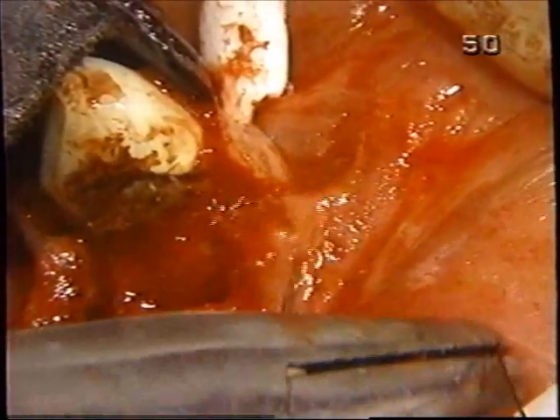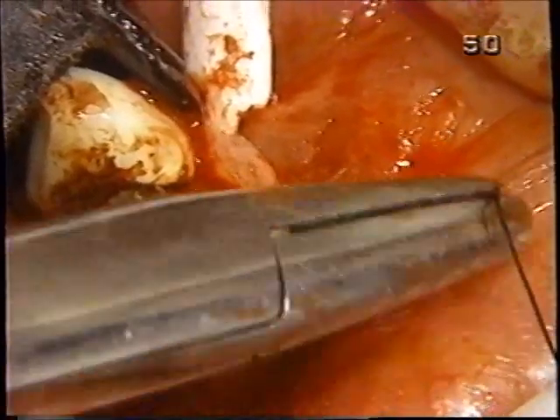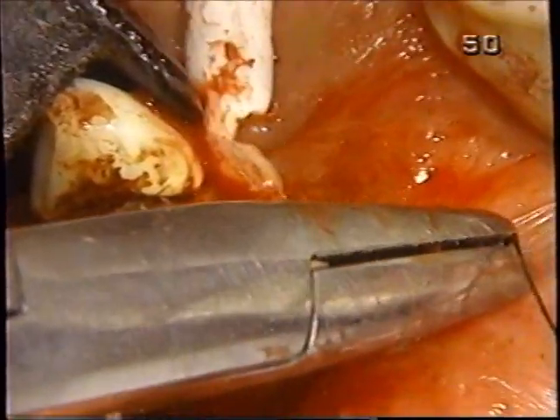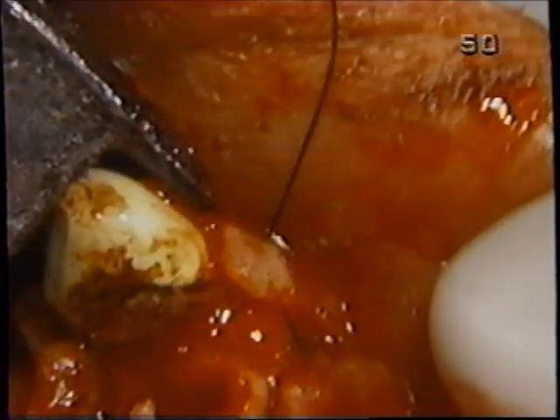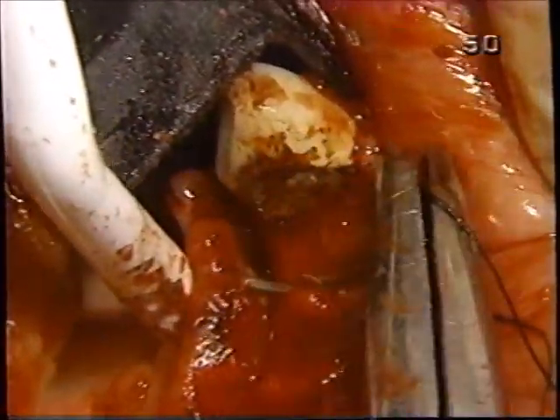Are you feeling something? And if you've ever tried to suture a releasing incision with an X1, you know what I mean. It's fine for the flap part, but when you go through the fixed side of the tissue, the X1 invariably will lacerate the tissue to death. Let's see, I don't think the FS2 will get all the way through in one swipe. Would you press on that? Yeah, great, thanks.